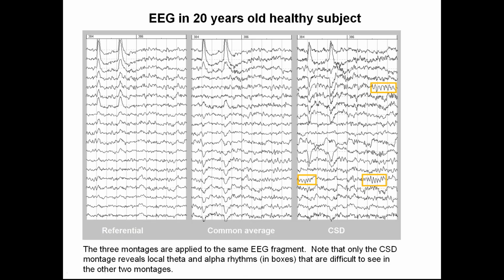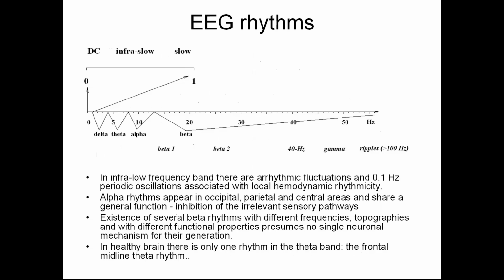So what I am trying to show on this slide is that even using different montages, you can obtain more information about brain function, but definitely not just by looking at the EEG. You need to use sophisticated methods for extracting this important information from the brain.